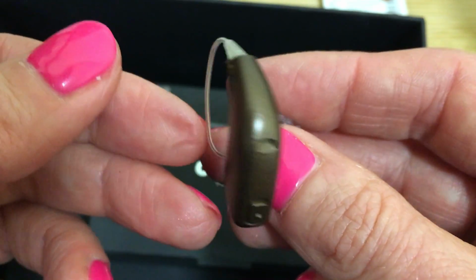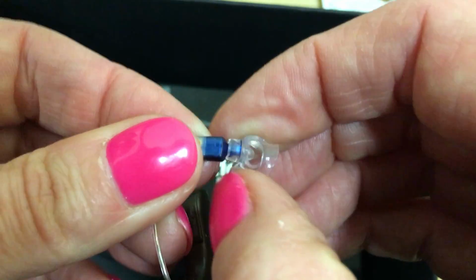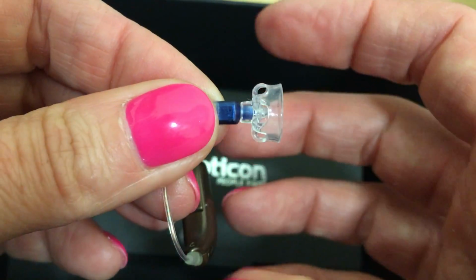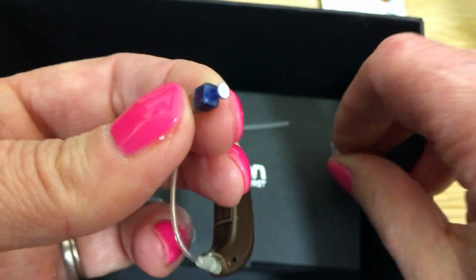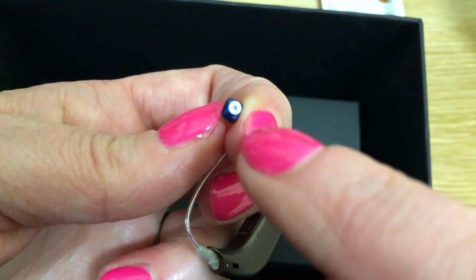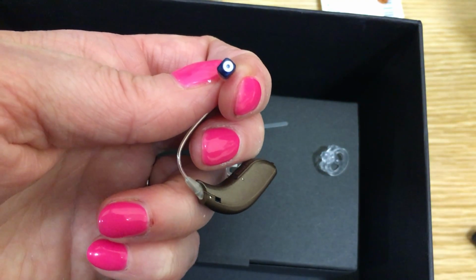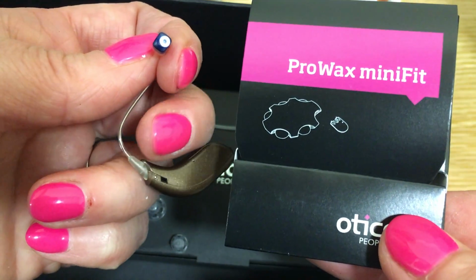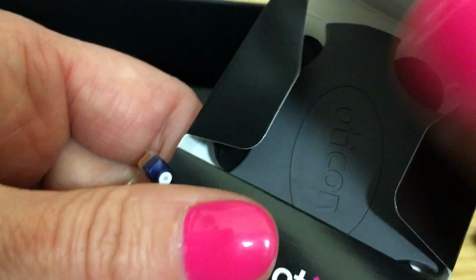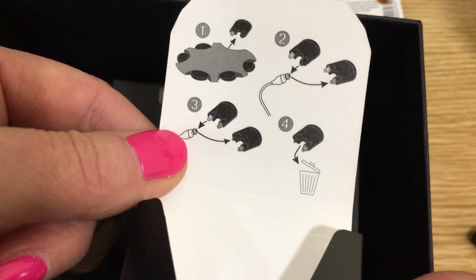Every so often it's important to check that the wax filter is clear from wax. We lift the skirt of the dome, wriggle the dome off, and inspect the filter. If this is blocked with wax, we will then take our mini fit wax filters. There are some instructions in the lid of the packet.